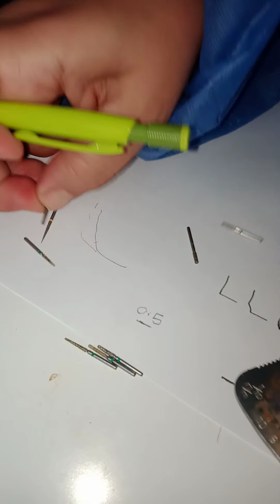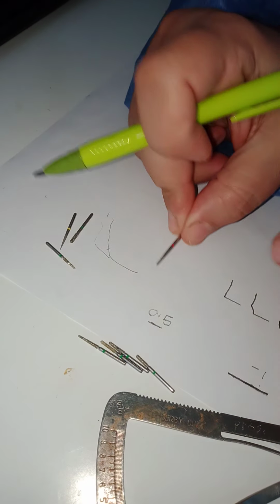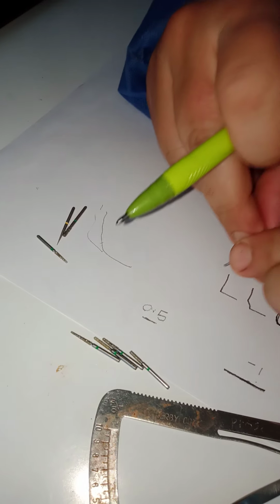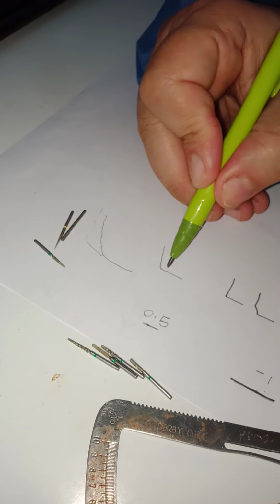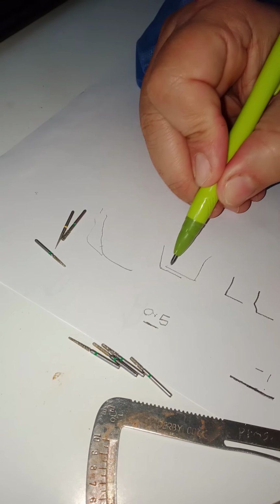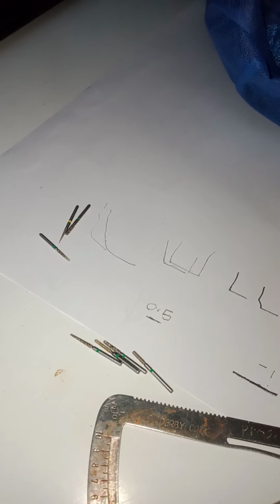So I use thinner burs, and I know this is a 0.8, so I don't go all the depth in it. I simply leave part of it. So let me magnify this. I only want to go 0.5, and the bur is more than 0.5, so I leave part of the bur outside. So maybe 2/3 of the bur is working, and this is a 0.5.